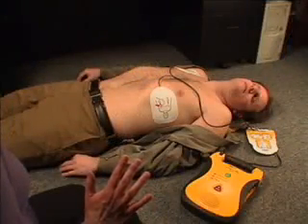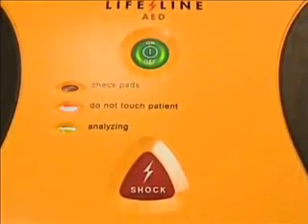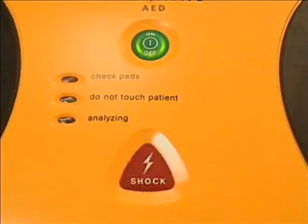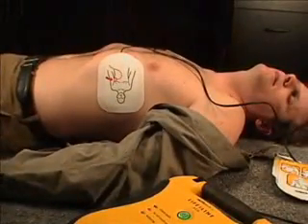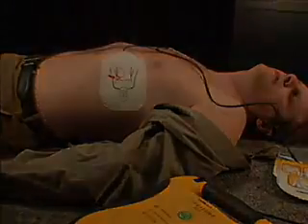Shock advised. Charging. Stand clear. If a shock is required, once the AED has fully charged, the shock button will flash and the AED will instruct you to press the shock button. Press the shock button to deliver a shock. Shock 1 delivered. It is safe to touch the patient. Begin CPR now.